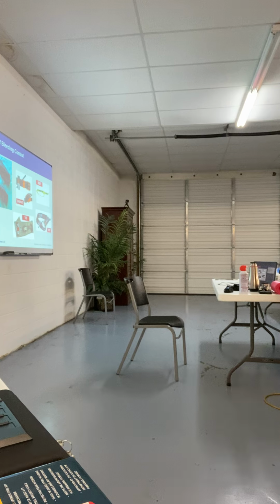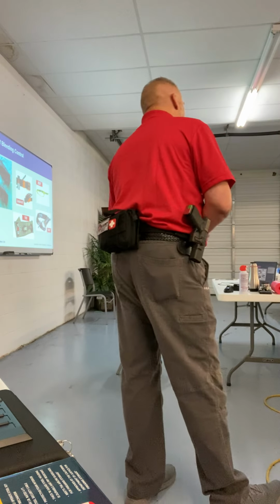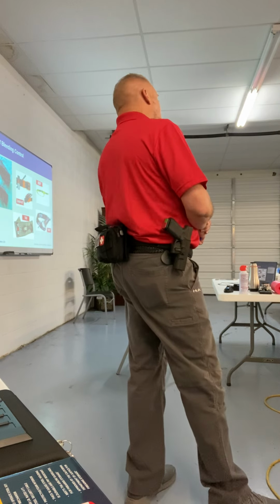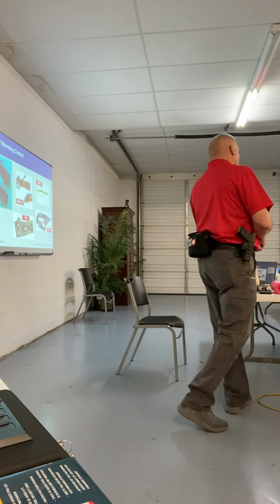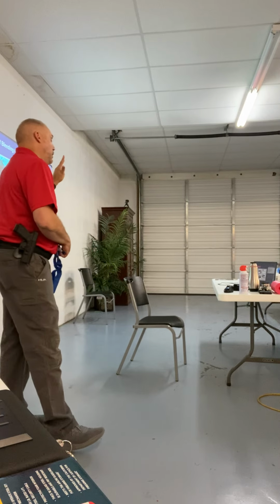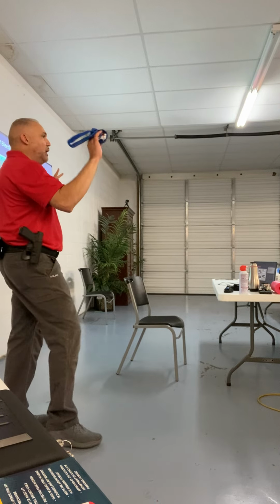So, 200-pound Christy could bend that windlass. Do you think that's a good tourniquet? Wow. No. Where do you think that tourniquet came from? Somebody used it already. Walmart? It's been used a lot, maybe. Hadn't been used at all. Oh, really? Just poor quality. So, you get a tourniquet from Alibaba, eBay, Amazon, and the tourniquet costs $1.98. You're going to die. That's what you're looking at right here.